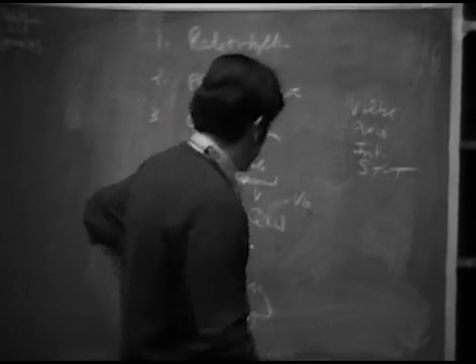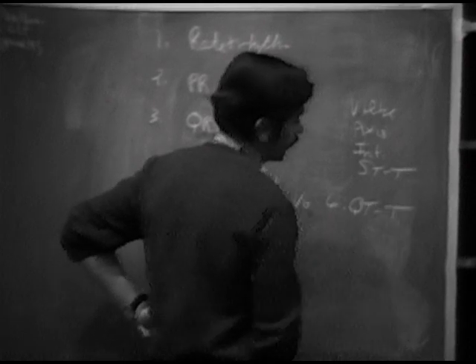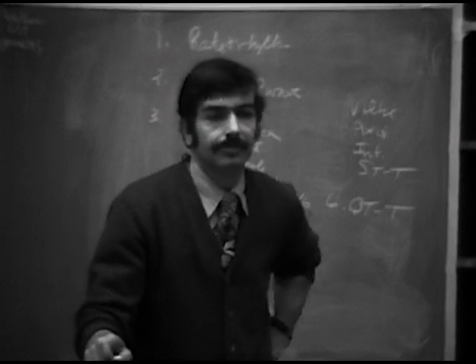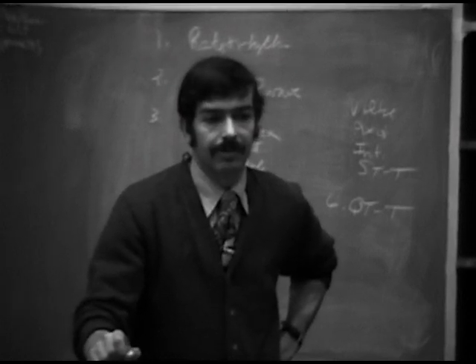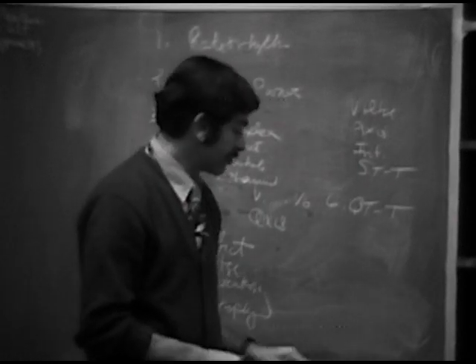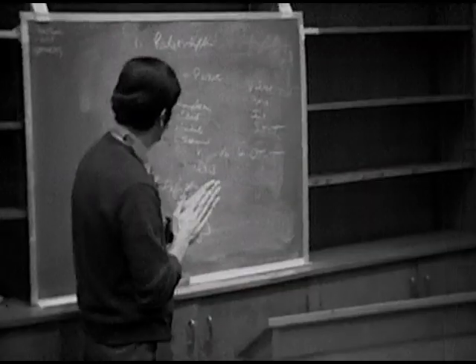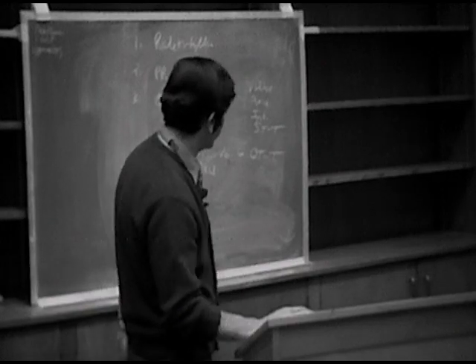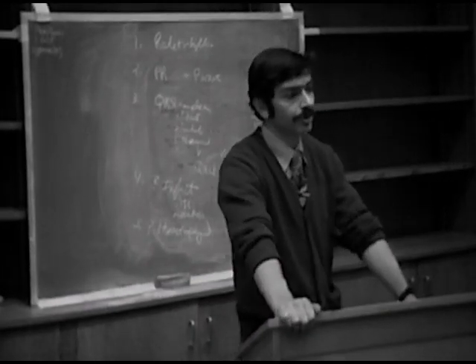And then finally, in the last step, you look at the QT interval and T wave changes that you have not yet already covered, and decide whether there's drug, electrolyte problem or non-specific ST wave changes that you haven't already covered. So this is a 6-step routine, and as I said, we found this quite valuable in approaching the routine electrocardiogram.